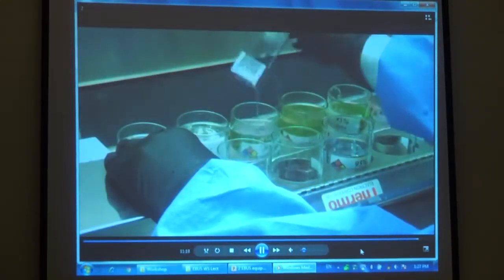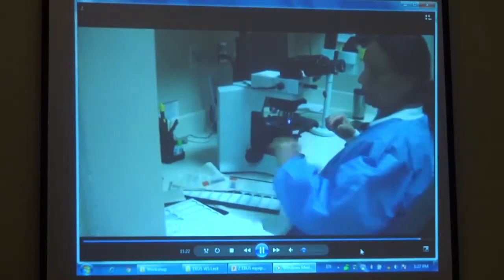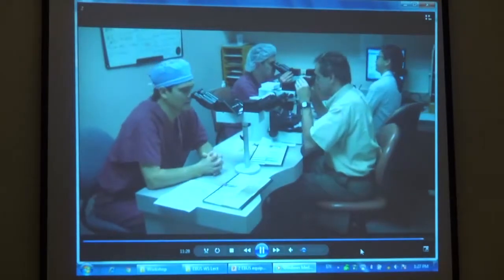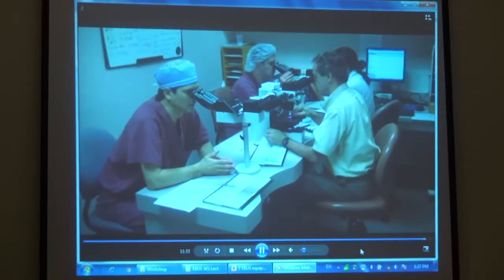Additionally, the finding of a positive nodal station, for instance a contralateral N3 station, may negate the need to perform additional biopsies in more proximal stations. Regardless of whether ROSE is available, it is useful for the operator to examine the specimens they have obtained with a cytopathologist, as it provides a useful learning feedback loop.